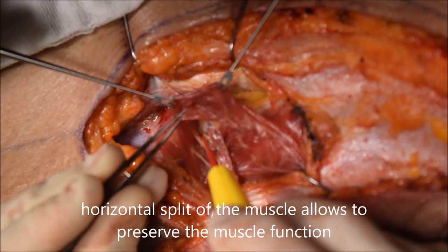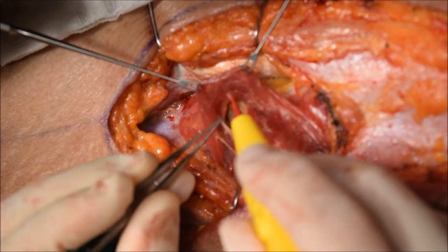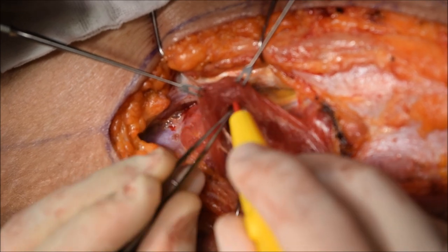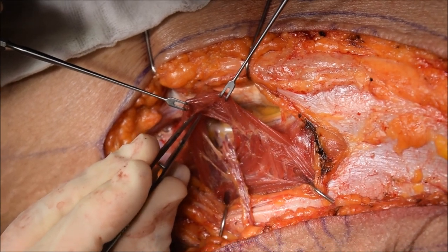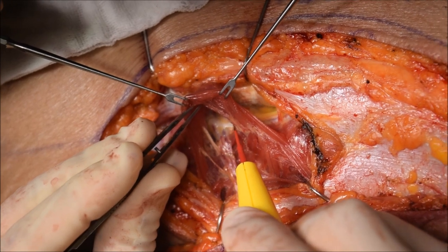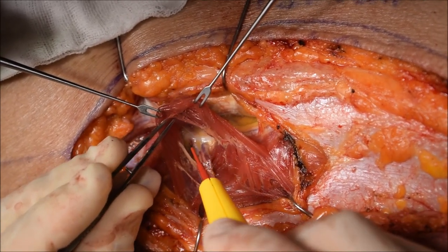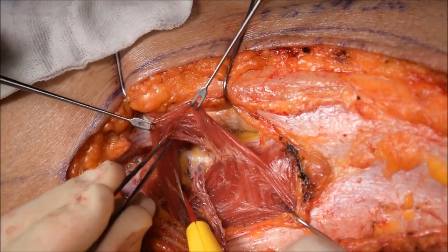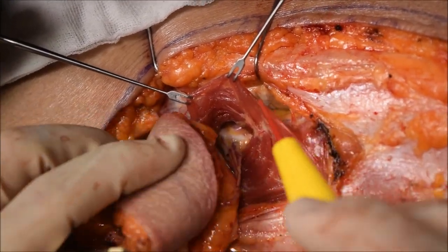Now once you split enough, we want to pass the flap within that split portion to allow better visualization. As you reach the source vessel — now we've reached the source vessel, which is the descending branch of the lateral femoral circumflex artery — we're making the pocket large enough for the flap to pass through that splitted muscle. Sometimes it's inevitable that you come across a nerve or muscle that you have to cut, but most of the time we try to have this horizontal dissection using a monopolar bovie to preserve maximal function.